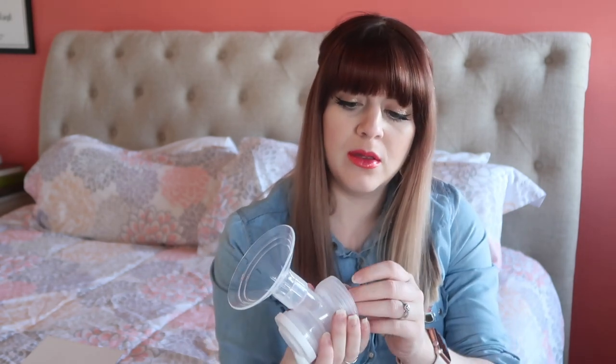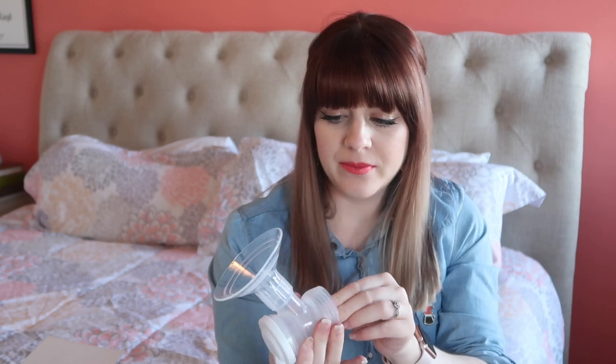All of the parts just look super easy to clean. Here's the tubing that comes with it — oh, there's actually an extra one in there too, so extras for that.